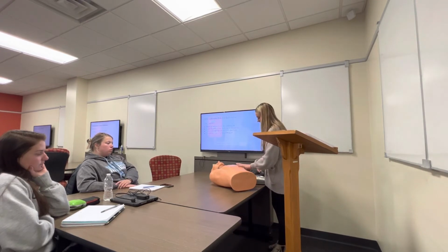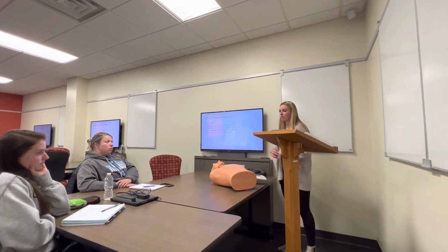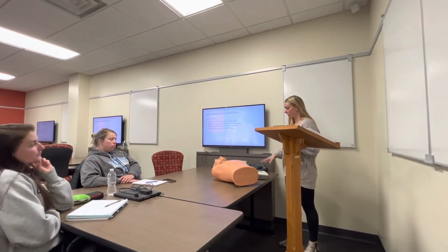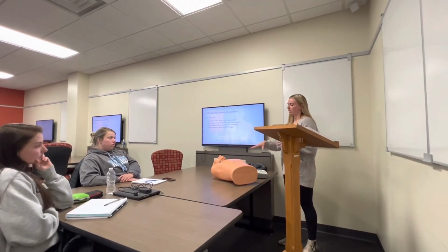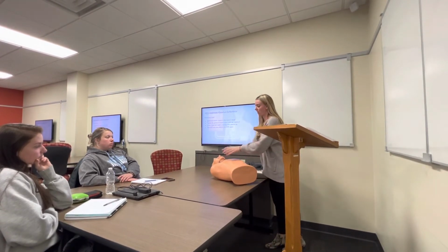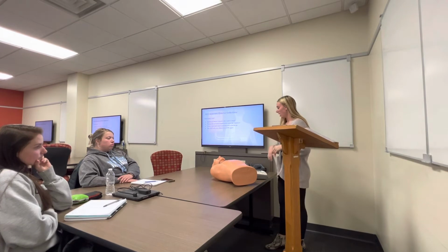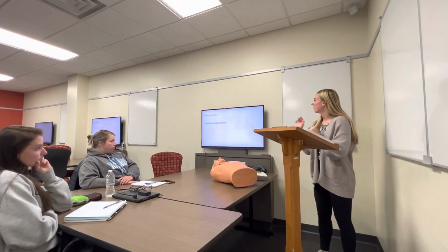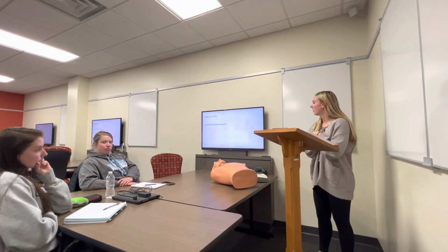And then when it's turned on, it will go through it and speak to you, and it will tell you when to shock. When it does the shock, don't touch it, and then you can continue doing the chest compressions after it tells you to. And then the 2 breaths. So we just have a short video here that will show you how to do it.